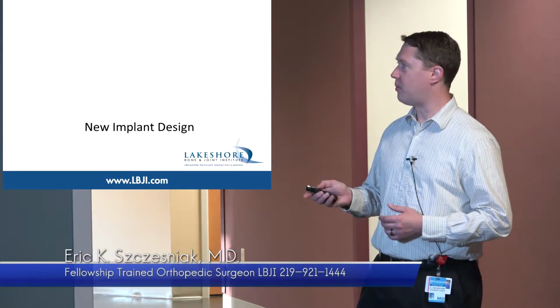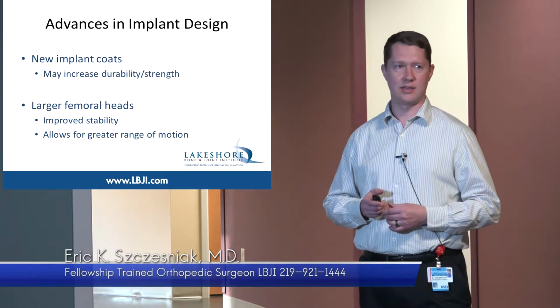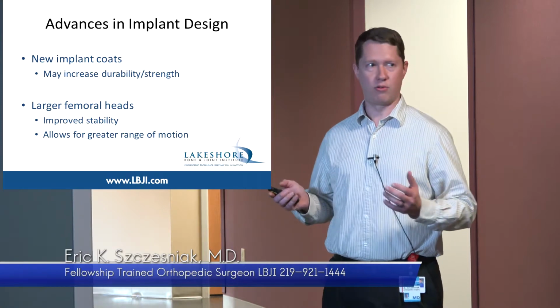We've changed the way that implants have been designed a little bit, and in particular, the two big things are that these foundation parts have been coated in metals and materials that have encouraged the bone to grow into them.